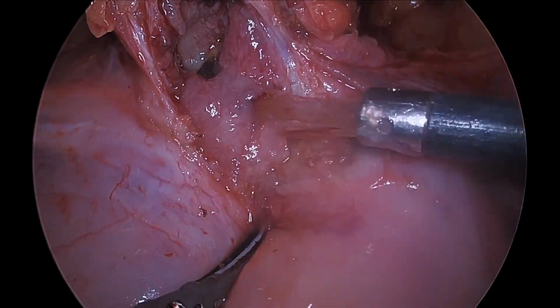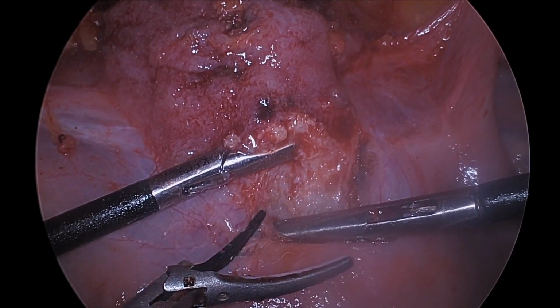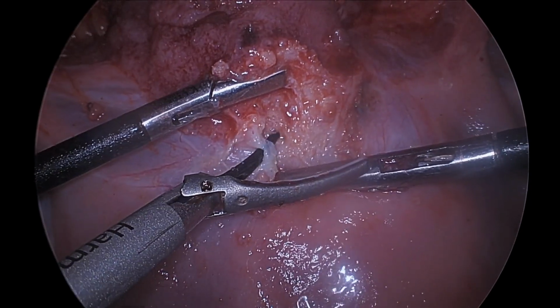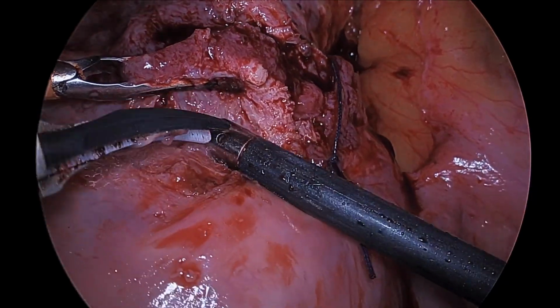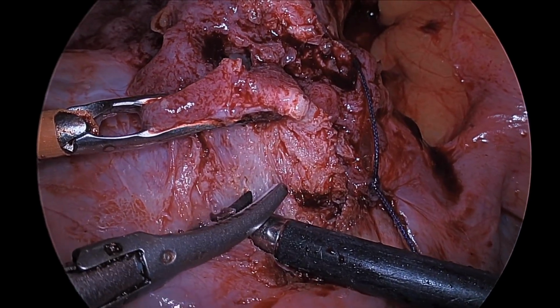A specimen retrieval bag was preemptively placed into the abdomen to retrieve tissue. We continued to excise the isthmocele from the surrounding myometrium. The bleeding was extremely minimal due to the mechanical hemostasis with the bulldog clamps and chemical hemostasis with the vasopressin. We did, however, encounter venous bleeding, requiring suturing to obtain hemostasis. There was a total estimated blood loss of only 30 cc's throughout the case.